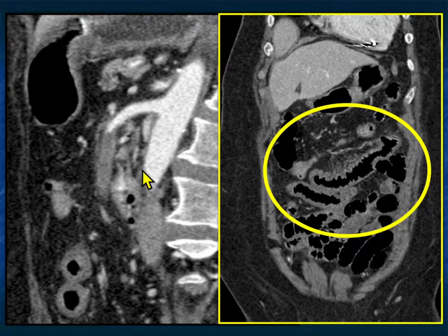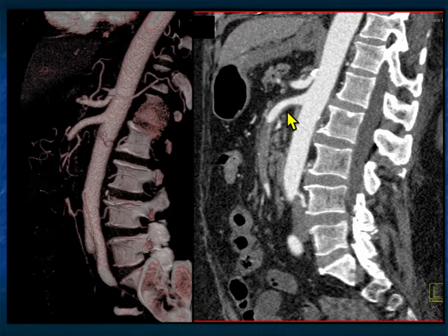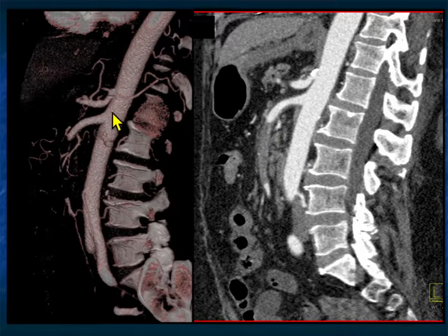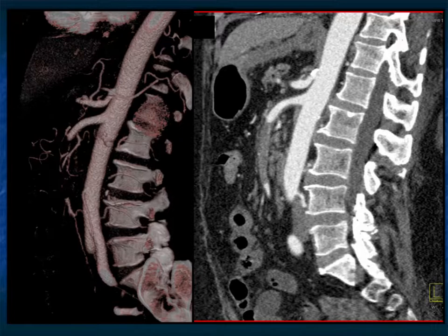Here it is on the volume rendering and on the axial. Celiac and SMA look great proximally, but look at the extent of the thrombus — a very important finding.